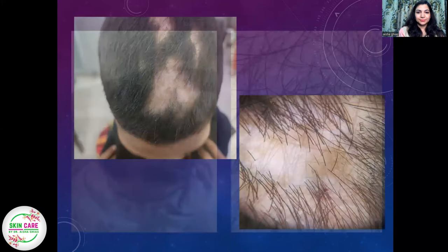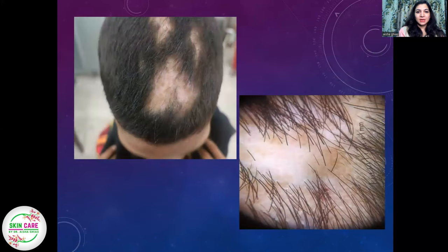Okay, so another patient with hair thinning on the top of the scalp, and on trichoscopy, these are maybe coarse terminal hair, broken hair. So let me know, what do you think about this case? This was case number eight. Case nine, what do you think about it?